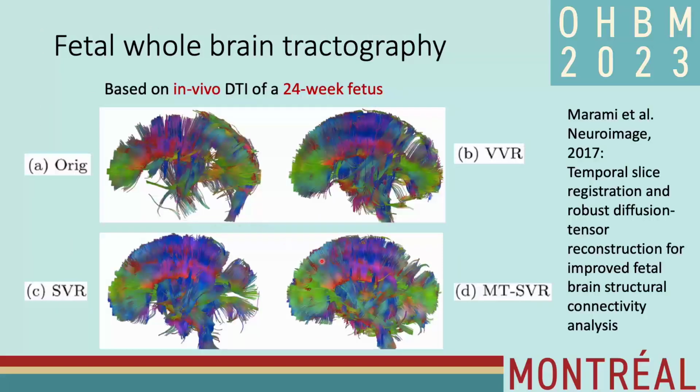This allowed us to do whole brain tractography with much improved results compared to other techniques, and this figure shows an in vivo DTI tractography for a 24-week fetus, which is quite impressive of how many connections and structures you see at that age.